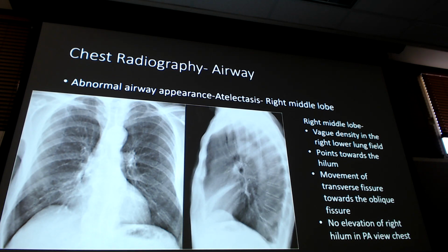So let's just do this versus pneumonia too, right? Besides symptoms, what is another main thing of pneumonia versus this one that can help you kind of distinguish between them off of how the image looks? What is pneumonia? It was in what category of disease? The alveolar air space disease, which was what? Patchy, fluffy, hard to see the borders all the time. These are pretty clear borders.